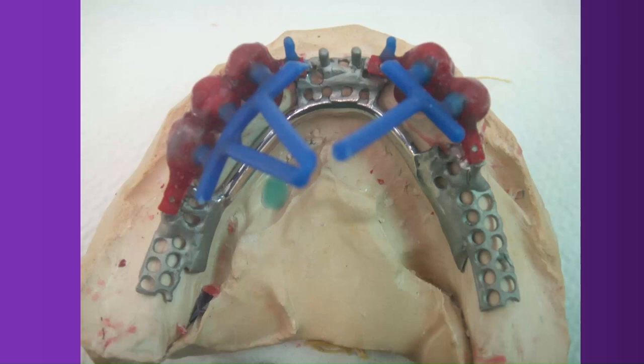That was back then. So now you see the removable part. That was gold palladium. Those are the secondary copings over my primary copings. And this was the main connector, cobalt chromium, and that was to be adhesively cemented in four conjunctors.